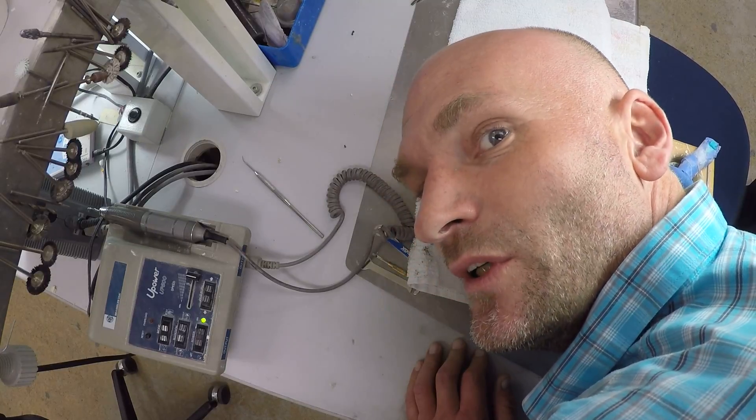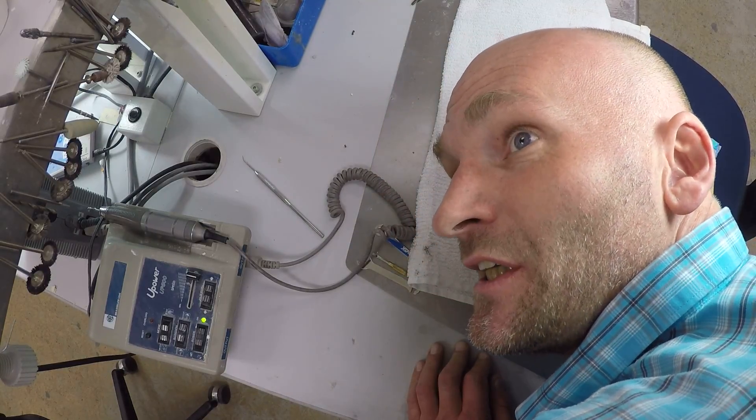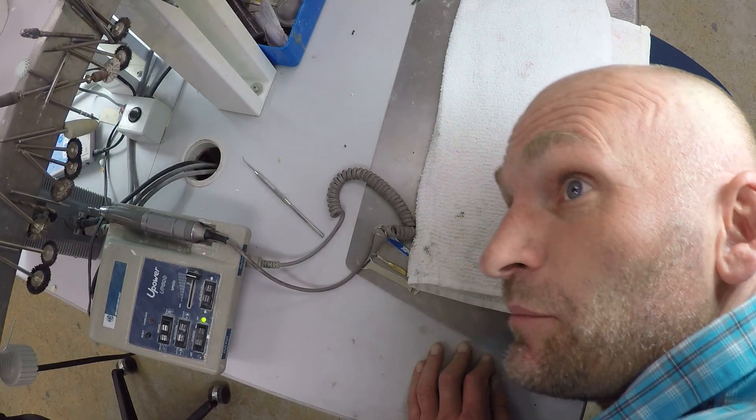Hello, can you see me? Hi, this is Christophe from CAD Dental. We are going to change the brushes on a handpiece today.